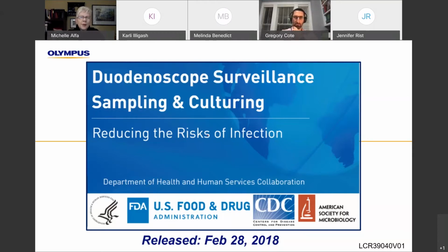The other couple of tests that are out there that are not addressed in the FDA protocol are, there is an overnight rapid gram-negative test that is commercially available, and it can detect low levels of gram-negative organisms. But keep in mind that the action items given in the FDA protocol are based on the detection of all high concern organisms.